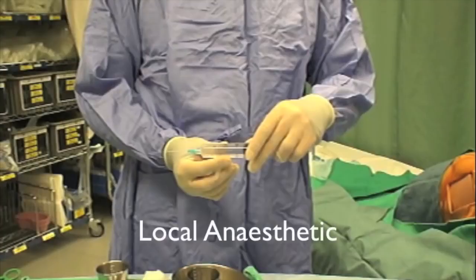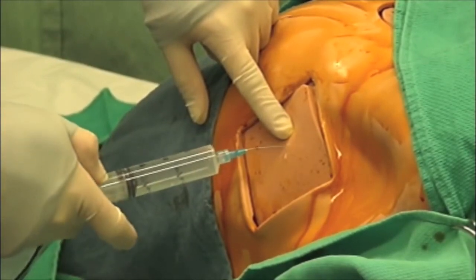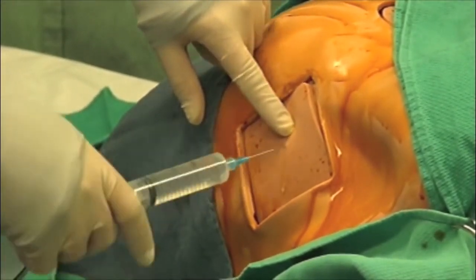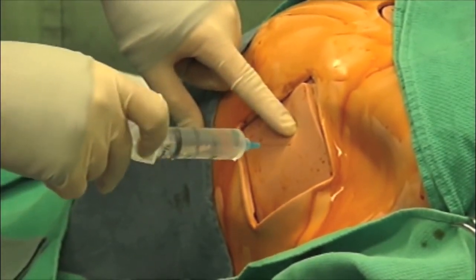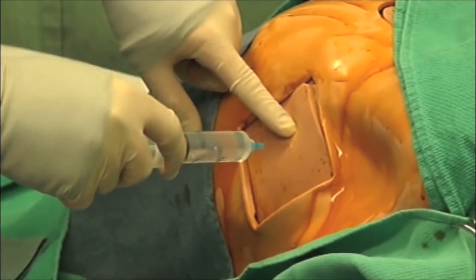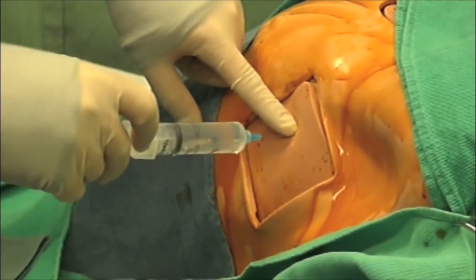Draw up 20 cc of lidocaine. Re-landmark and infiltrate the skin using a 25 gauge 1.5 inch needle. Inject over the superior border of the rib to avoid the neurovascular bundle. Anesthetize the periosteum.